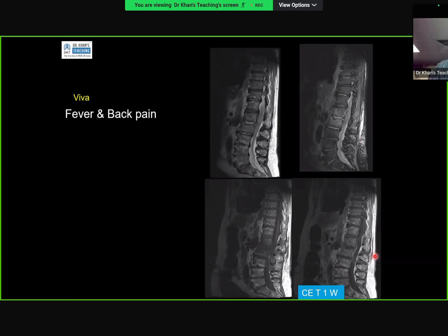In a liver abscess, this happens every day, and you might have seen cases where you're worried about infection, and you will tell the clinician. They will say, "Can you drain it for me?" And you will say, "We'll wait another 24 hours or 48 hours, and we will rescan. And when there is a liquid component, then we will drain it." So that is a very, very important concept in the spine, very important concept in head and neck also. Subperiosteal abscess of orbit, etc., etc.